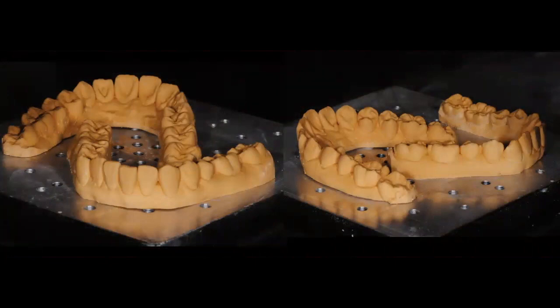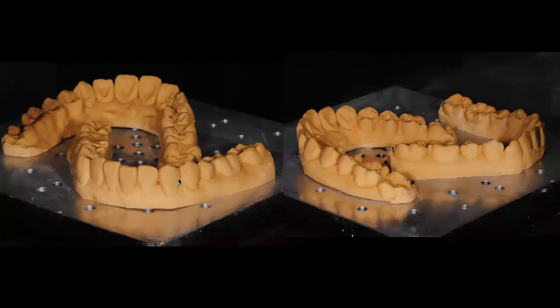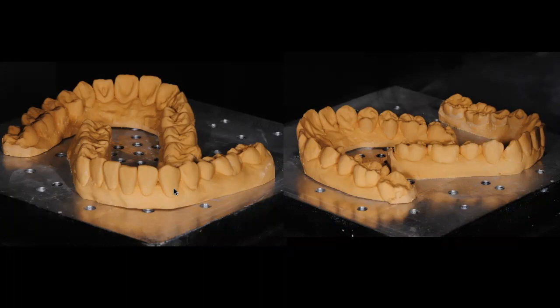One of the things I recommend when it comes to fabricating your trays and selecting the tray design is that I like trimming my cast very, very thin. You can see that they're not that tall. By removing as much stone as you can, you will achieve this U shape of the actual model. When you get this U-shaped type of model, I normally fabricate both bleaching trays using one clear soft tray.